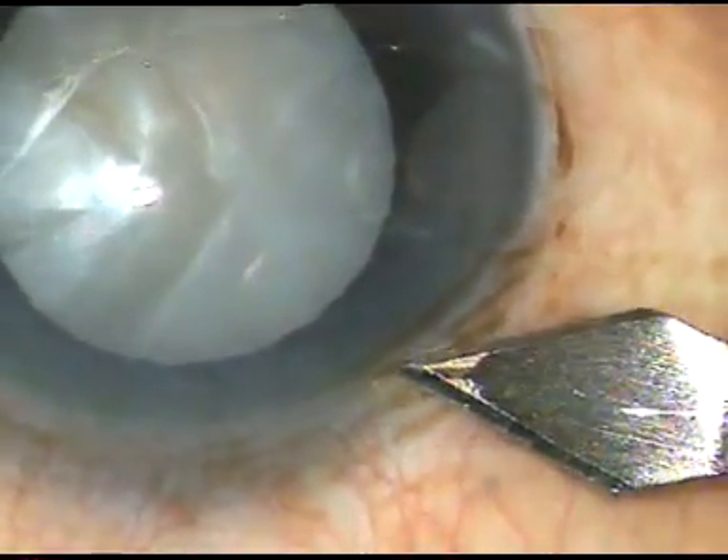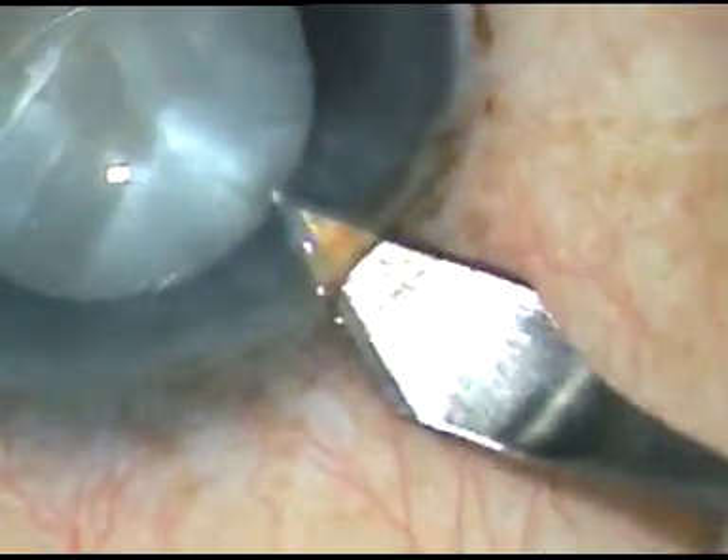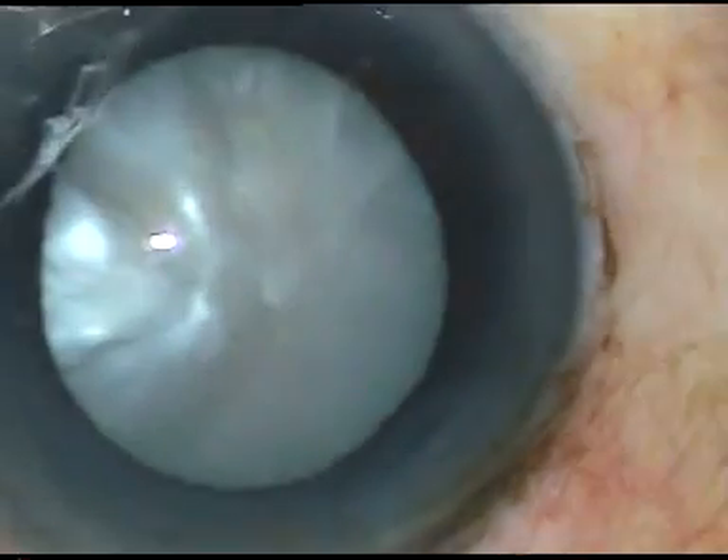Dear colleagues, this is an intumescent cataract with very high intralenticular pressure. I have taken up this case for surgery. Let us see how the case was done.